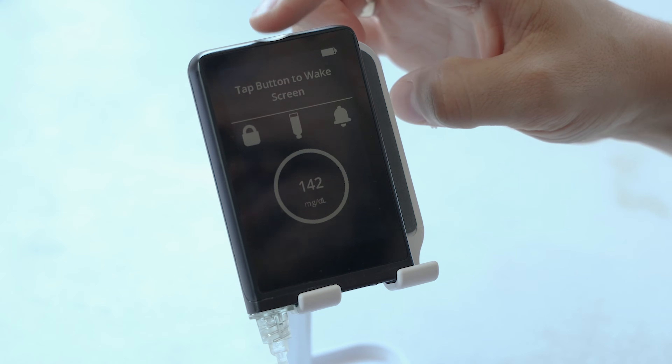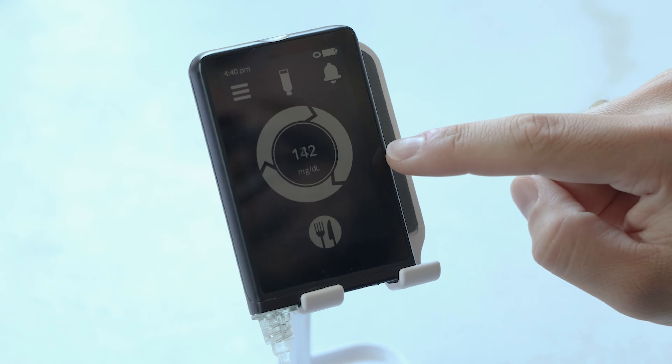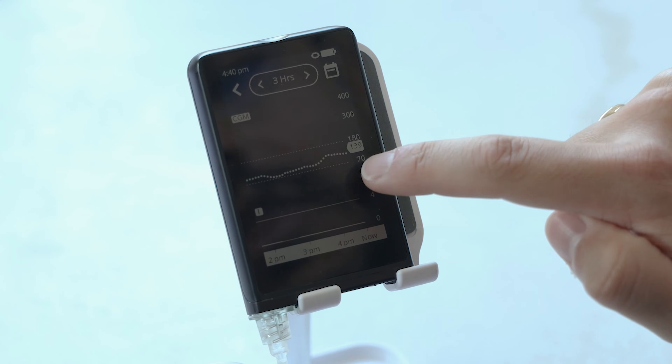I've got the ILET Beta Bionics pump right here, and I'm going to walk you through how to use it. In order to unlock it, you just hold down on the top, then there's an unlock swipe. It's unlocked. This is the home screen in the center. You've got your blood sugar level, and if I tap in there, I can see the chart — you can see the three hours.